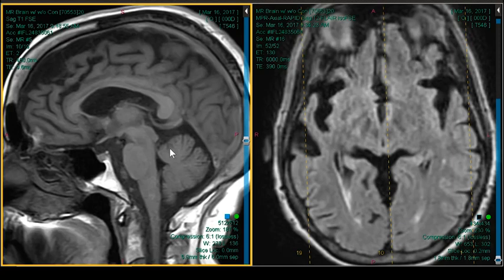Now, the other one would be hallucinations, okay? Visual hallucinations, think Lewy body, because Lewy body has a less specific anatomic pattern. So Parkinsonian with hallucinations, okay, but maybe a less specific anatomic pattern. Before you even get to the images, you already are narrowing your differential, okay? So really look at these histories, and if you have access to the clinician, it can help you out. This one, the imaging is very strong, so we have a good idea, and the callosum is thin. So try to anatomically parse out these things and have a good dementia search pattern, getting the most out of the history that you do have.